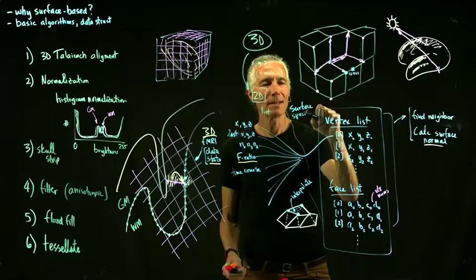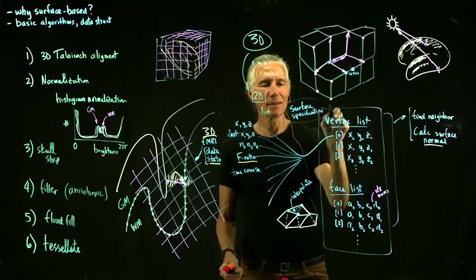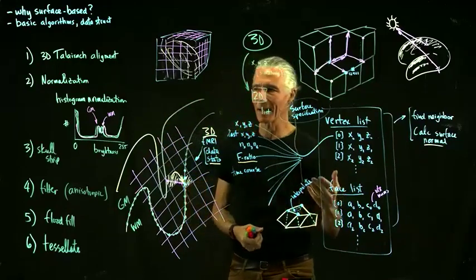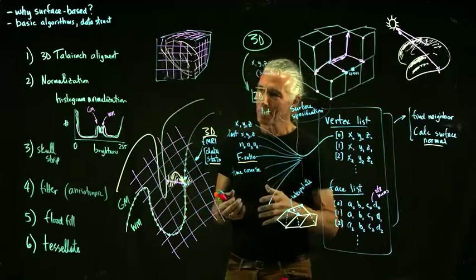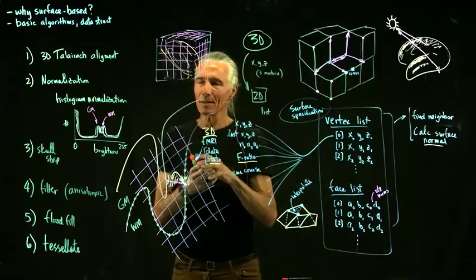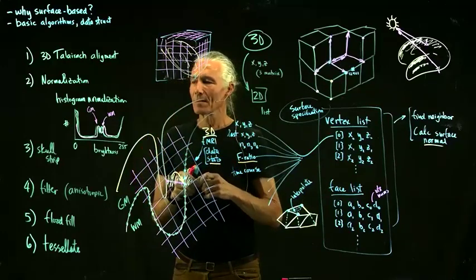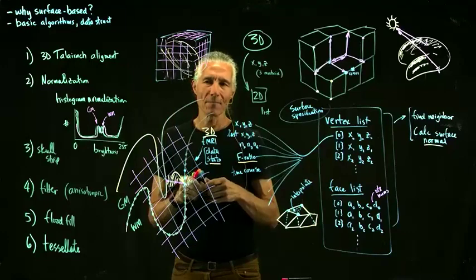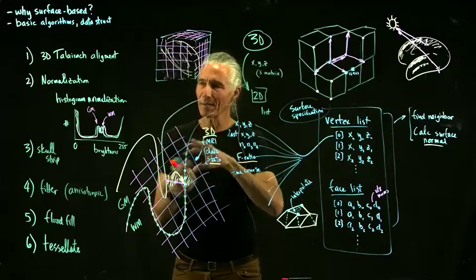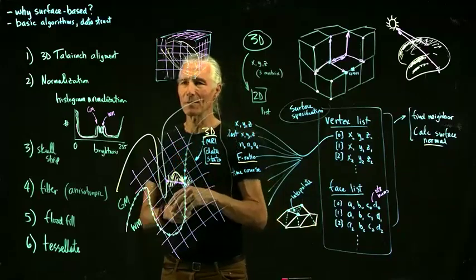But there's a lot of advantages to it because the cortex actually is a surface. It isn't just a 3D block of voxels, and so there's a lot of extra information you're adding here. And as we'll see, you can use a surface to do a better alignment across brains than you can do by just sticking in 3D. And you can much more easily visualize where the activity is in the brain instead of trying to cut through in sections through the folded surface.